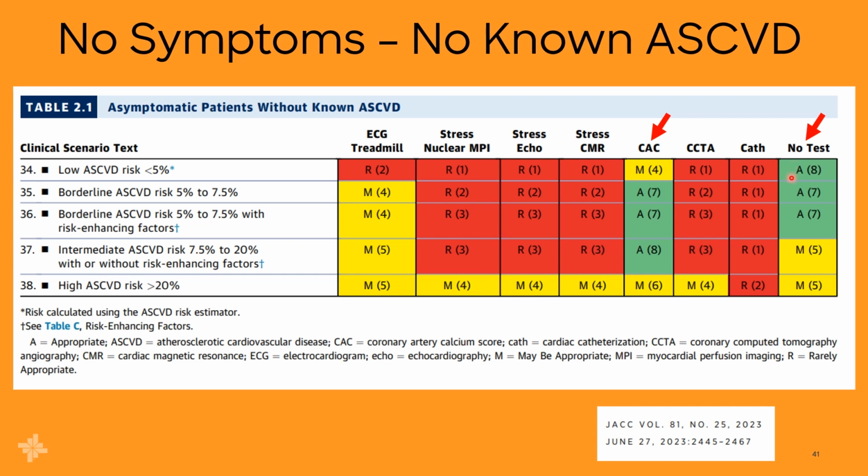But for the bulk of people who have risk factors and just want to know, they actually think that calcium scoring is a really good idea, a much better idea than doing stress tests where you can't actually get a sense for, number 1, do they have plaque? And more importantly, since there's up to a 20% false positive rate, if you have an asymptomatic person and then they come back with a false positive stress test, they're usually going to end up with more testing.